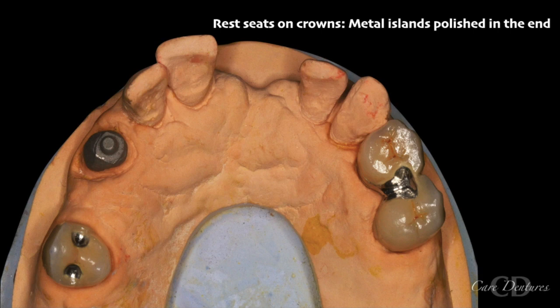In many instances, a surveyed cast crown or a bridge is a part of the whole treatment plan along with the cast partial denture. The rest seats in such cases need to be carved out on the crown, and the area in contact with the rest should be a polished metal island. No matter if it is a mesio or a disto-occlusal rest seat, or an embrasure rest seat with a little more leeway for the interdental minor connector for that matter.